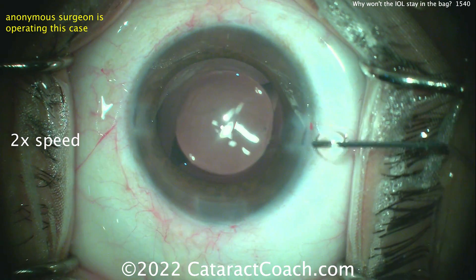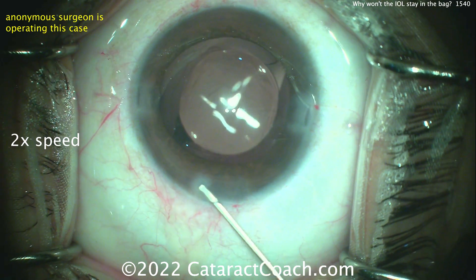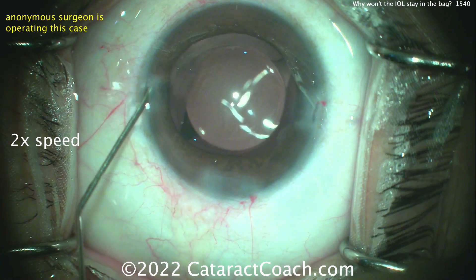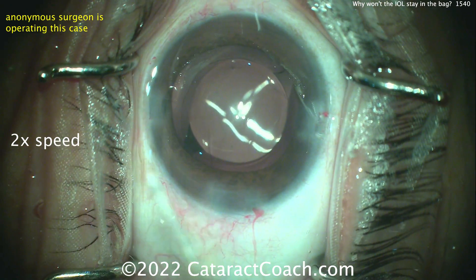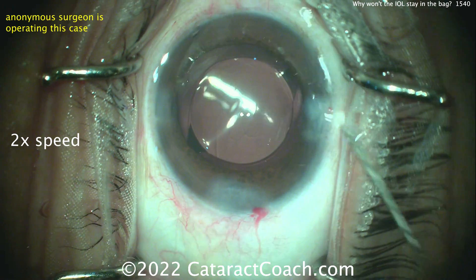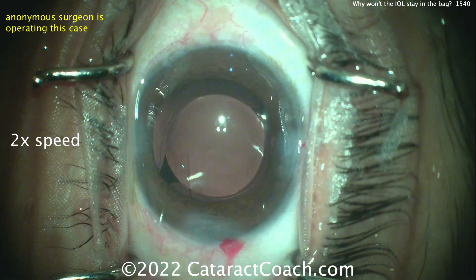First thing — let's seal the incisions, because obviously the incisions are leaking and the anterior chamber is going to shallow due to loss of fluid. If you seal the incisions, it should be a lot easier to keep the IOL in the bag. The rhexis looks pretty reasonable. Sealing the incisions and loosening the speculum — turns out that was the issue. Once the speculum is loosened, you decrease a lot of the posterior pressure being induced by it, and the case can be completed without any issue.